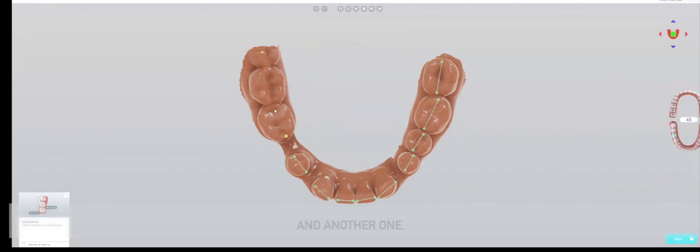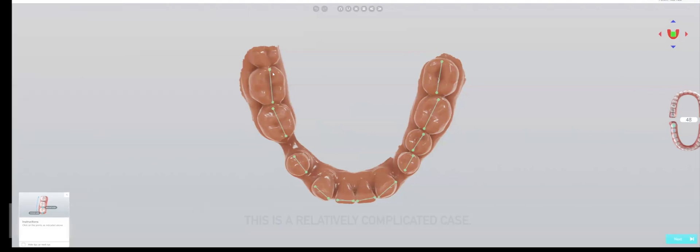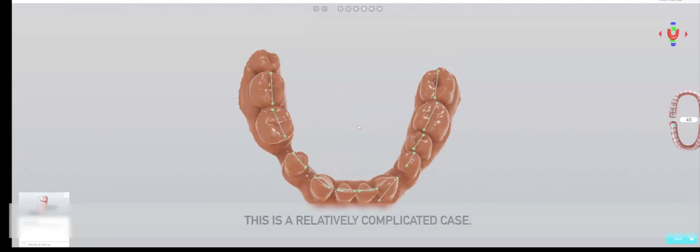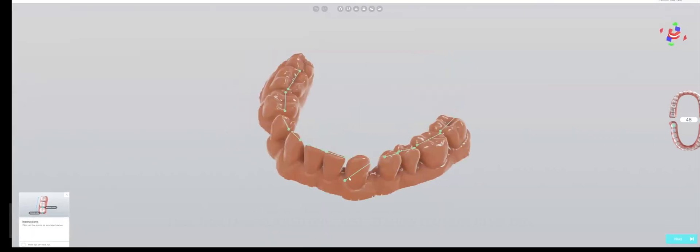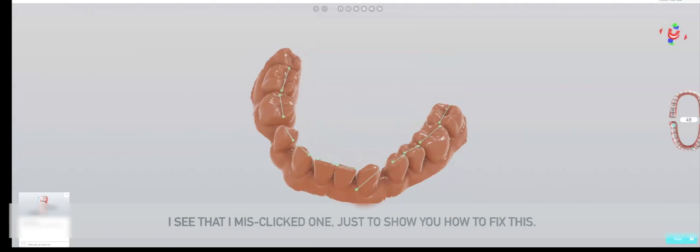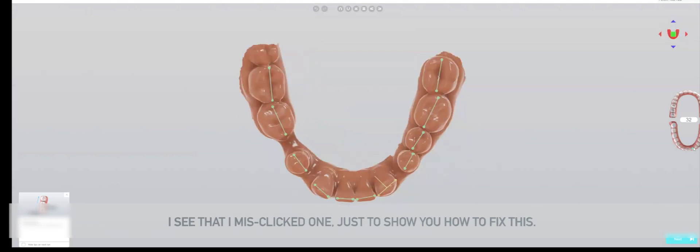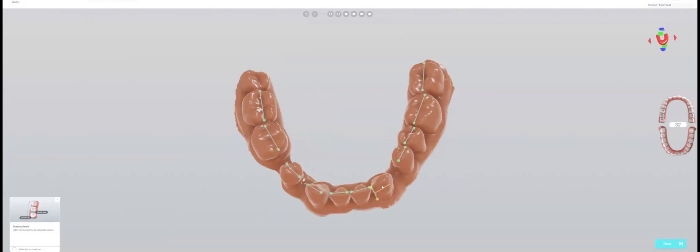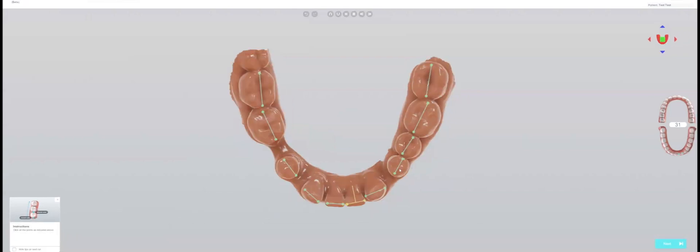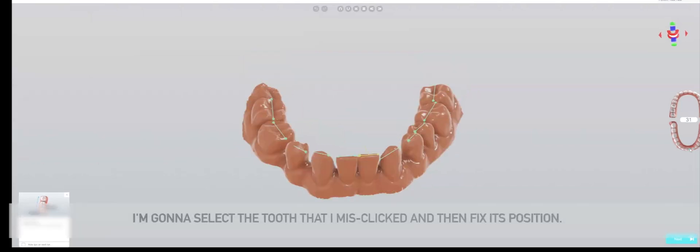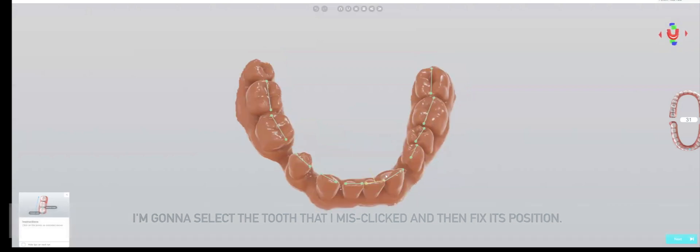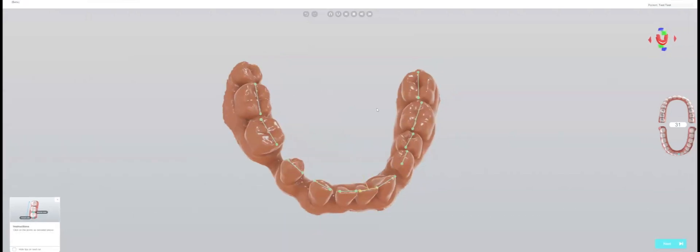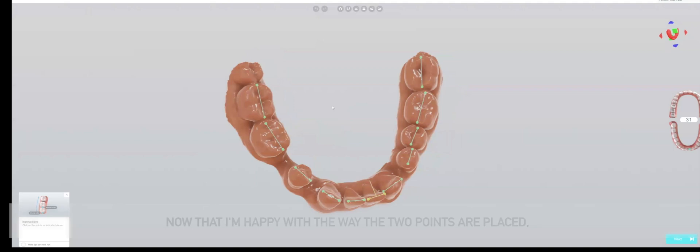This is a relatively complicated case. I see that I misclicked one, just to show you how to fix this. I want to select the tooth that I misclicked and then fix its position.